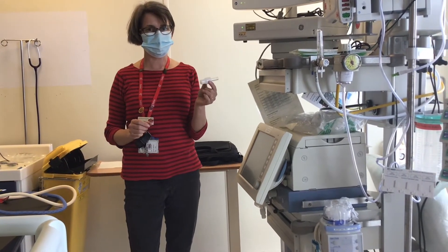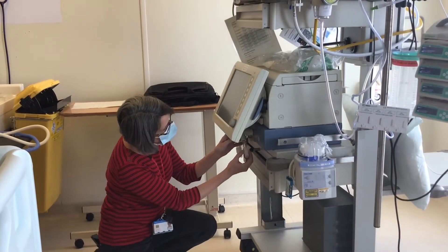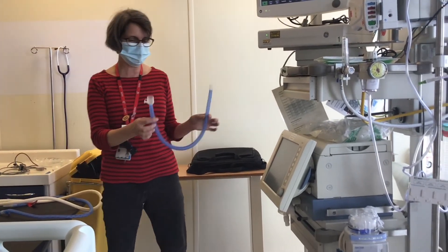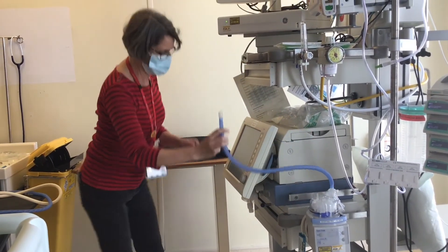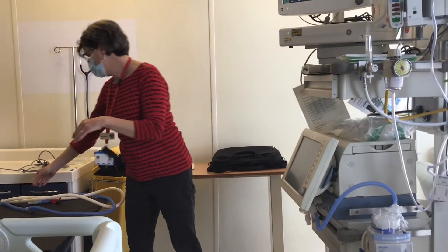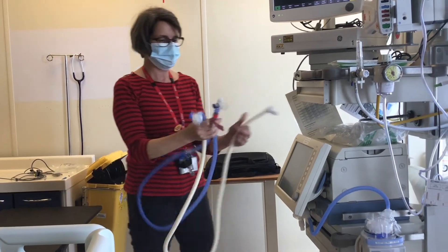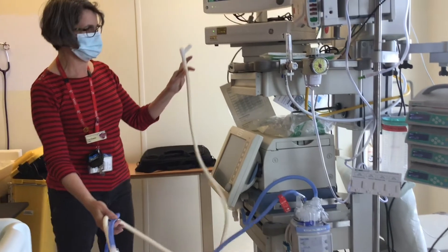On this ventilator, you also need a white and clear filter connector, which goes into your inspiratory valve. Take your blue short tubing — the large end goes onto your humidifier, the shorter end goes onto your inspiratory valve. Then take your connected tubing — the blue end goes onto your humidifier.